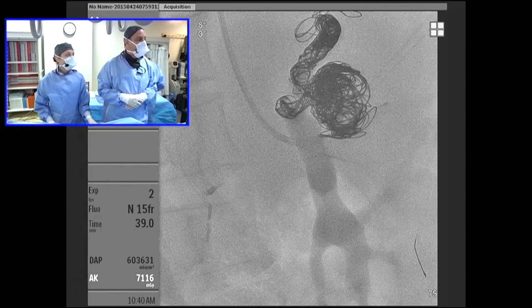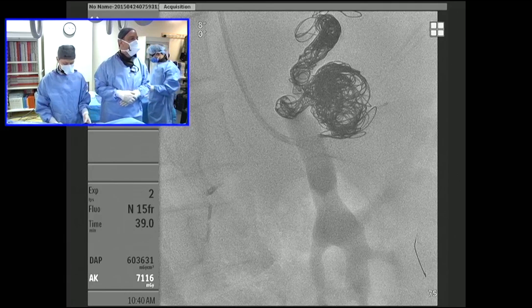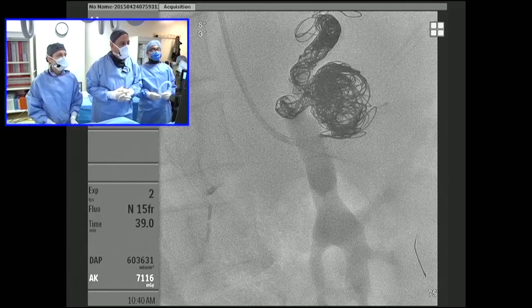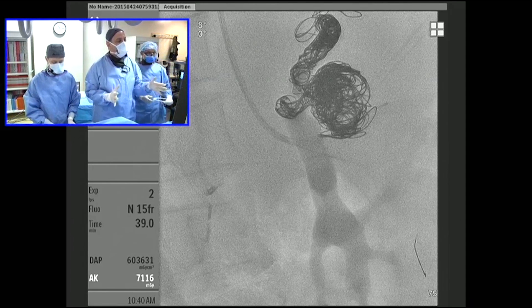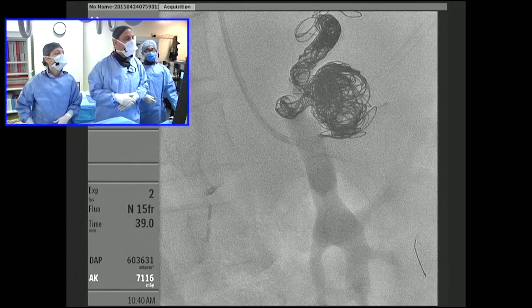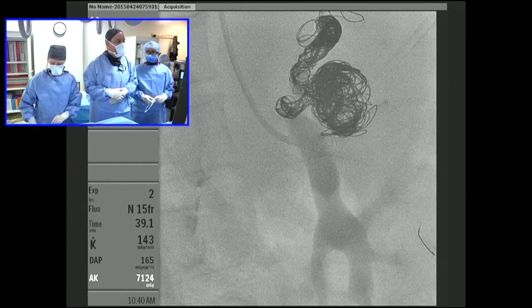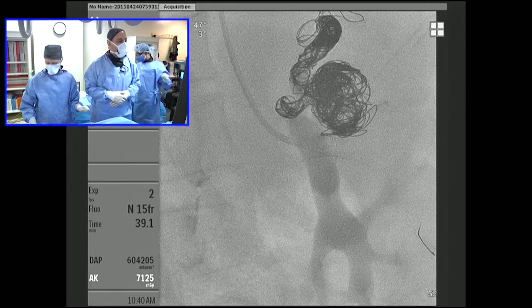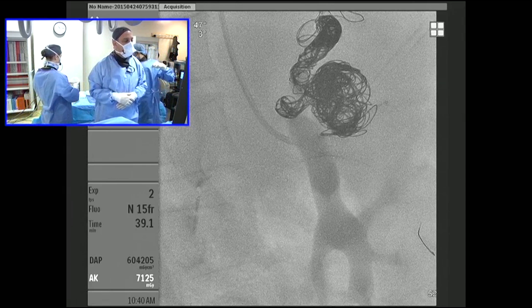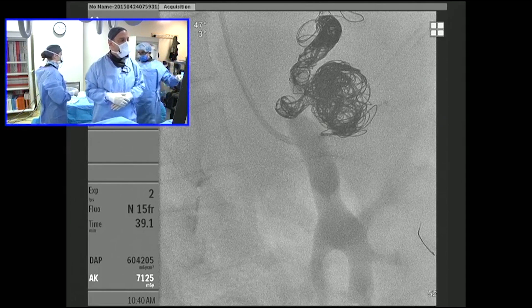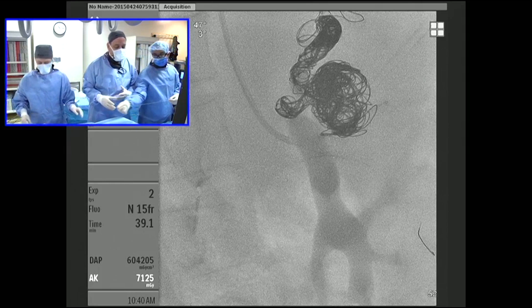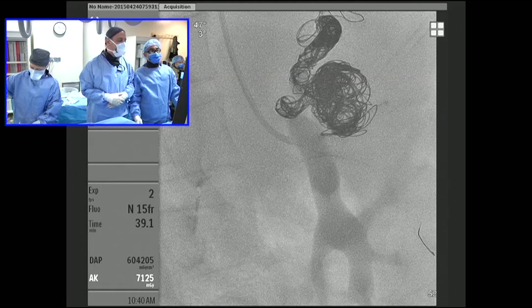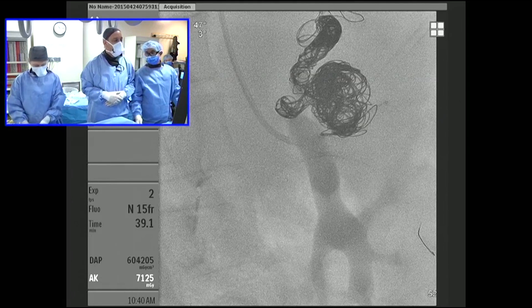If this patient were to have any evidence of an endoleak, the next step would be to place a covered stent across the neck of the aneurysm. My concern is that as accurate as we're trying to be, there's probably a good two- or three-millimeter fudge factor in stent placement here. I was really concerned that if we covered the inferior pancreaticoduodenal artery, we would potentially create end-organ ischemia to the liver. The patient understands the potential limitations, and she recognizes that if we see any evidence of persistent perfusion, we're going to bite the bullet and place a covered stent across the neck.